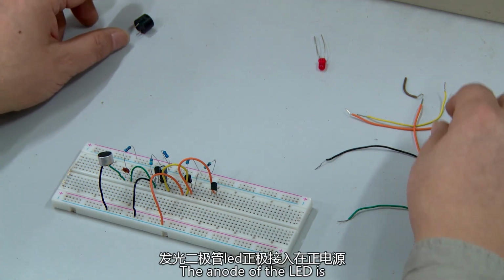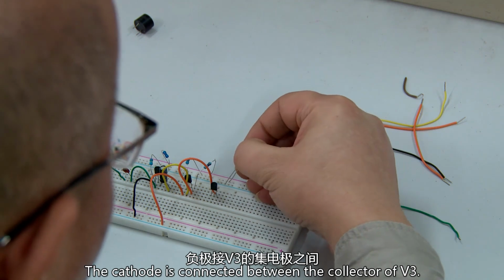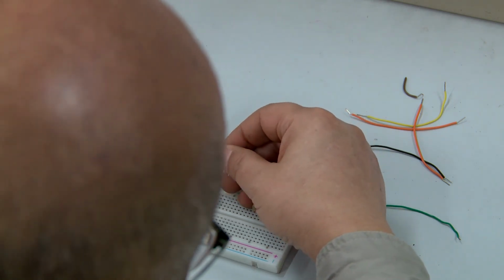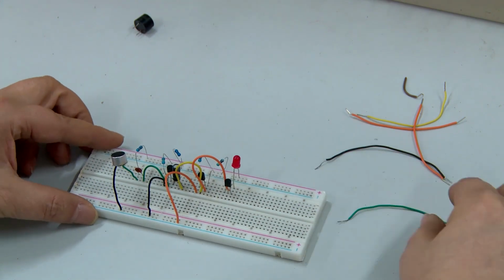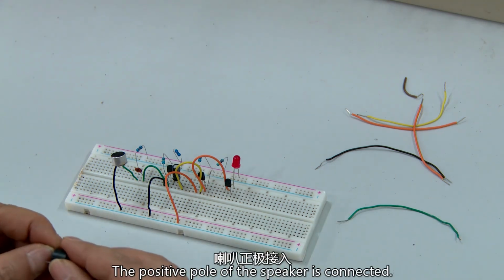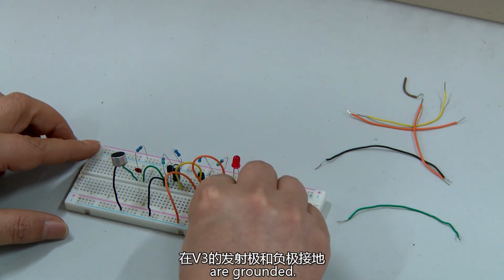The anode of the LED is connected to the positive power supply. The cathode is connected to the collector of V3. The positive pole of the speaker is connected. The emitter of V3 and the negative pole are grounded.